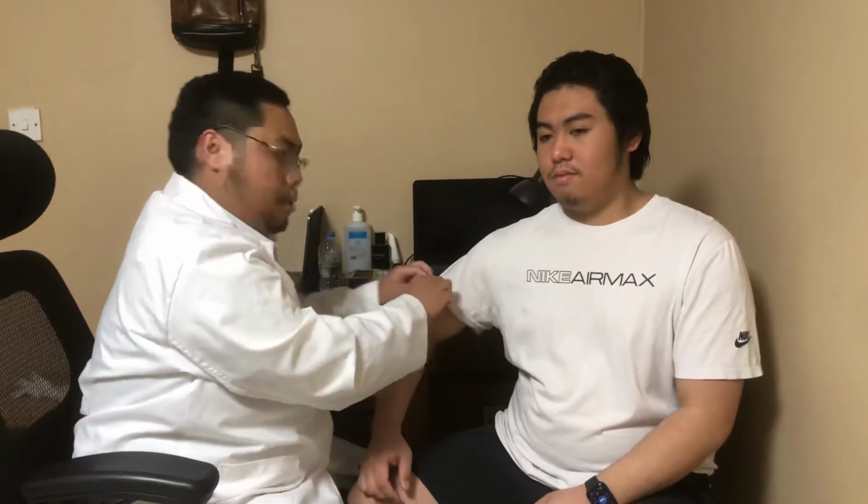So basically your temperature is normal, and that's really good. Assist the patient into returning their sleeves back. And now, note it down in your notebook. After this, wash the thermometer again with a CB solution and alcohol swab. The CB solution helps eliminate any bad odor and sanitizes it in order to accomplish comfort for the patient.